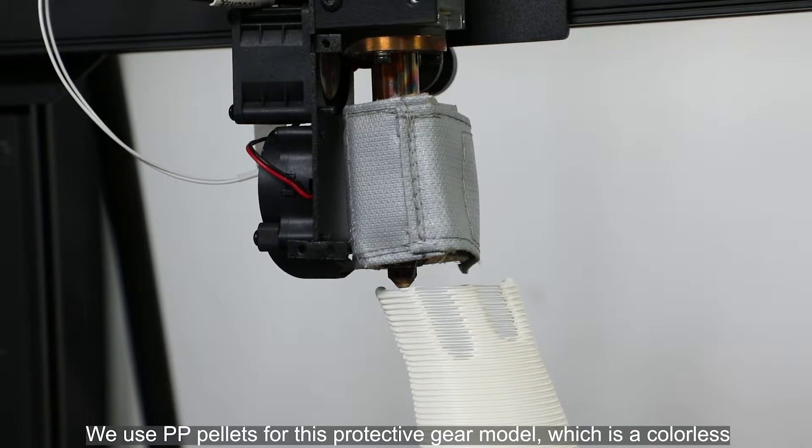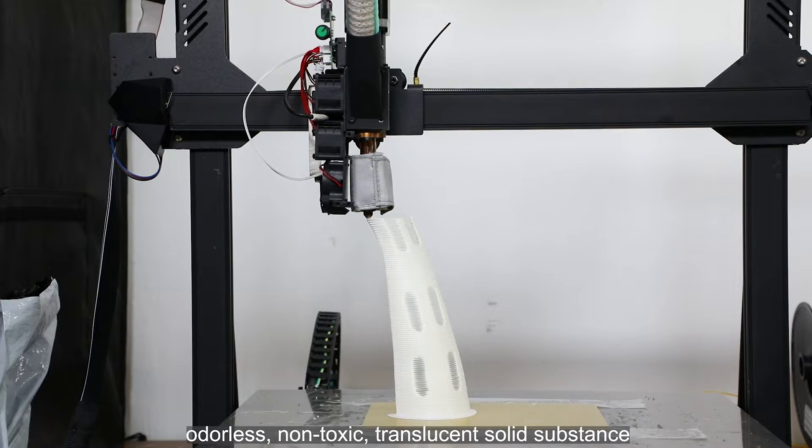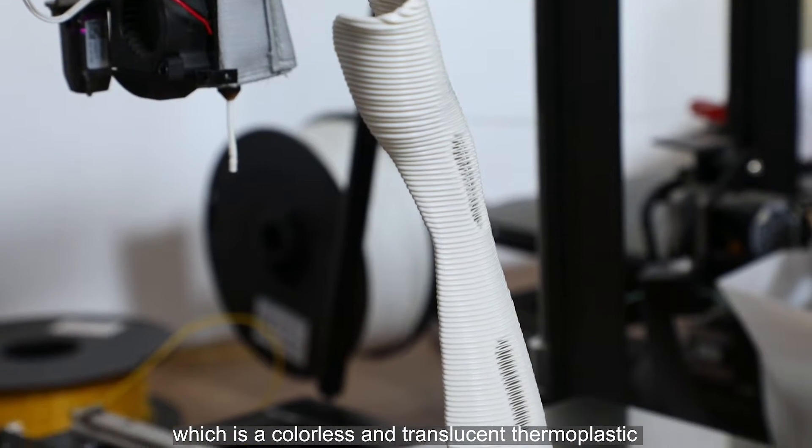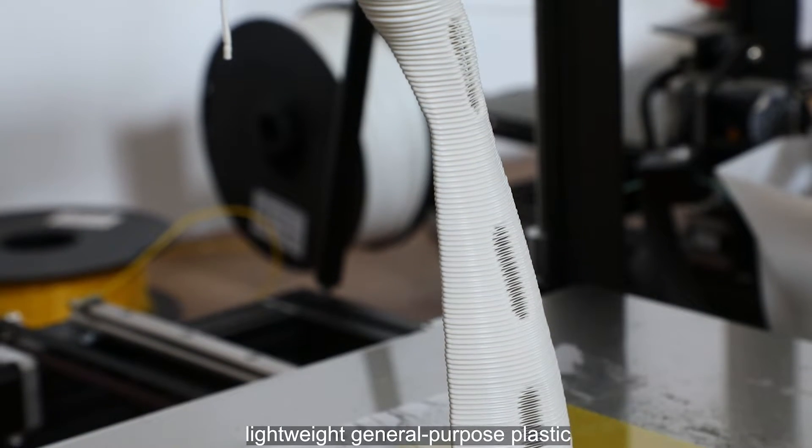We use PP pellets for this protective gear model, which is a colorless, odorless, non-toxic, translucent solid substance—a thermoplastic lightweight general-purpose plastic.